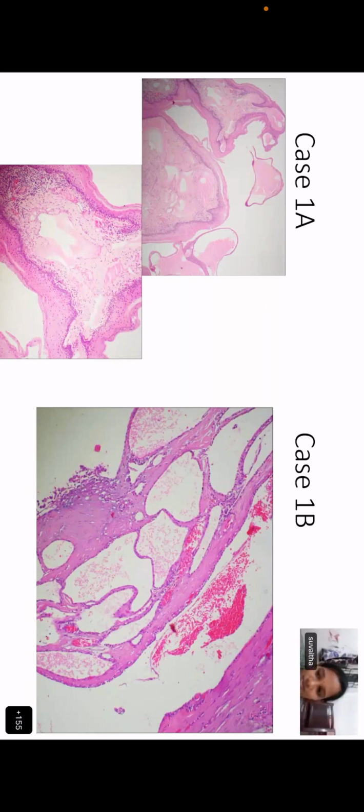It is a proteinaceous substance which is produced by the glands. Produced by glands. Ah, okay. So they have to be produced by glands. And yet, Sweta, you call this a secretion? You agreed that this was a secretion on the left-hand side. No, ma'am. So I think that by now we should realize that secretions are produced.